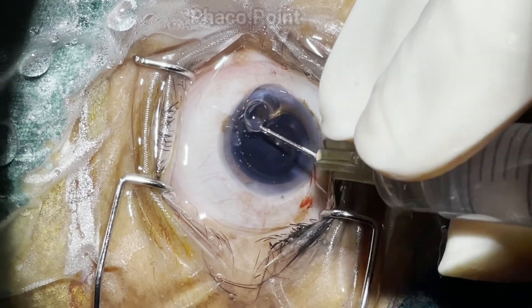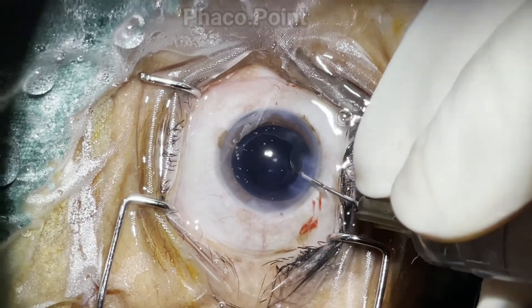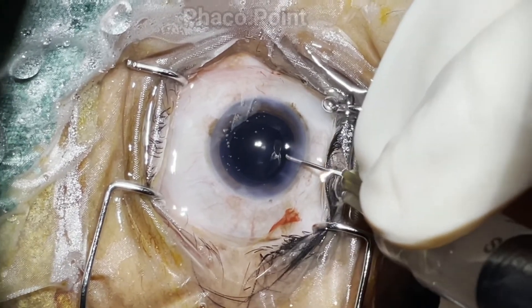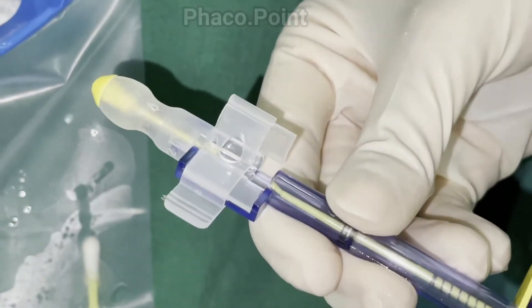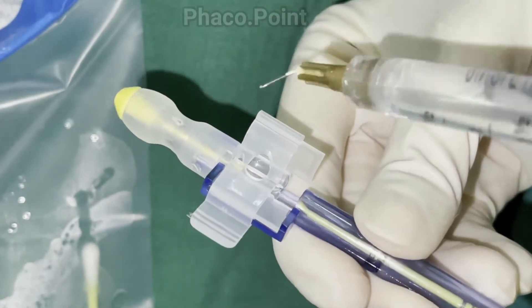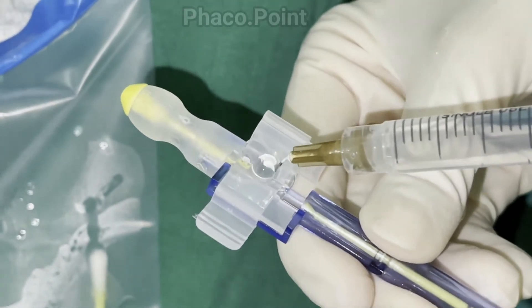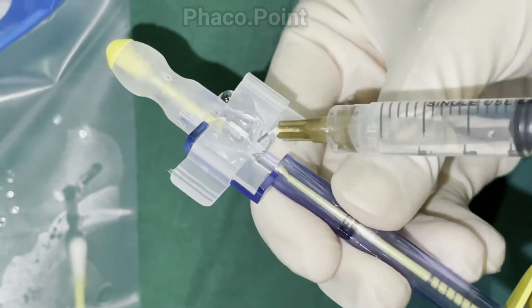Before implanting a three-piece IOL either in the bag or in the sulcus, it is extremely important that you insufflate the globe — that is, the capsular bag as well as the anterior chamber. This certainly helps in the injection of the three-piece lens. This is an Oralab three-piece IOL pre-loaded cartridge, so at the outset you put in some viscoelastic to fill the entire chamber as well as up to the nozzle.